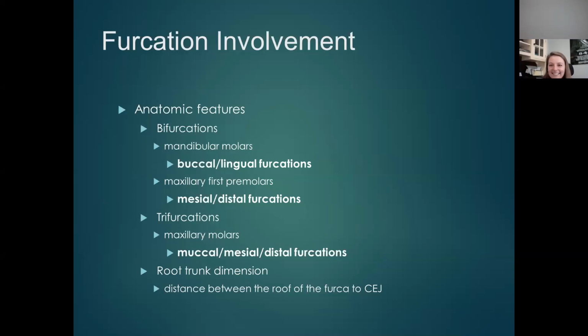You're checking for furcation involvements, and depending on what type of patients you've had so far, again, don't be afraid to ask for help when you're using your periodontal furcation probe, your Nabers probe, for the first time. You've never seen them before. You don't know how to use them. We are more than welcome and happy to help you.